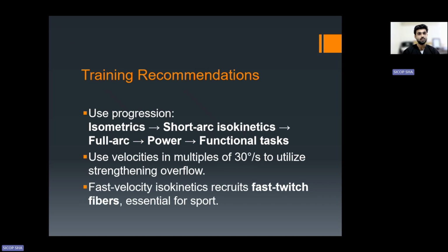So once we test an athlete or the person with an ACL reconstruction at 6 weeks for isometric testing, we can start training isometrically in the mid-range to activate the muscles. So how can we progress? We should start first by training isometrically.